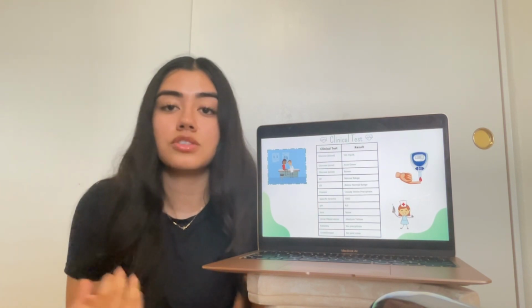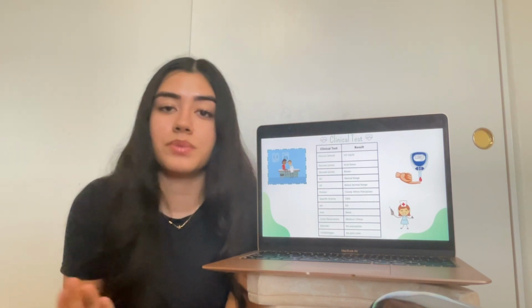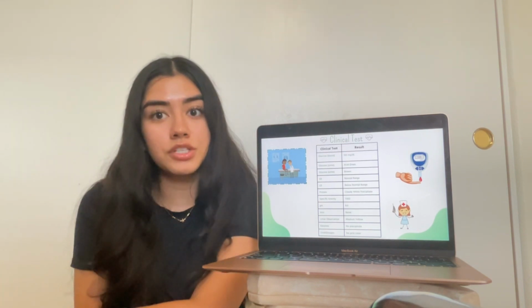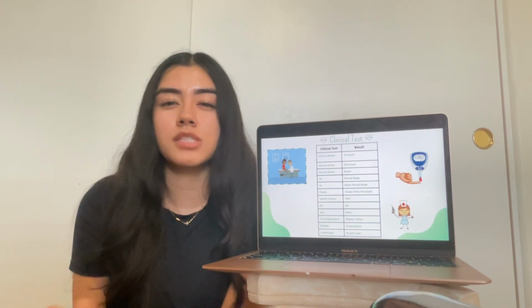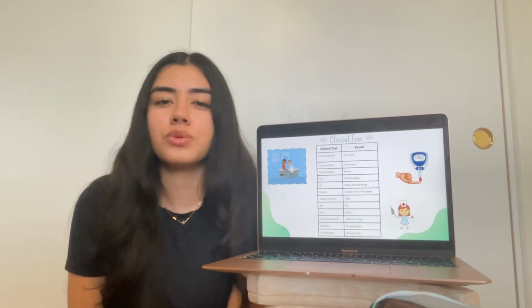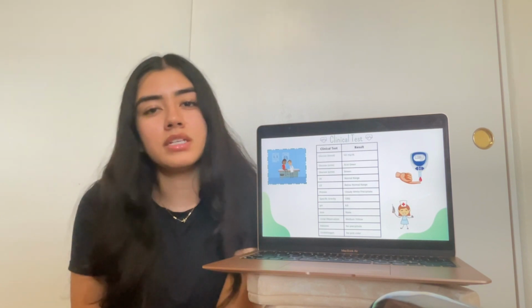Next, her protein test showed a cloudy white precipitate formation indicating proteinuria, the presence of excess protein in the urine. This might point towards kidney dysfunction, which is associated with conditions like hypertension and diabetes. The specific gravity of her urine was measured at 1.002, which is lower than usual and suggests dilute urine. Impaired kidney function could explain this finding.